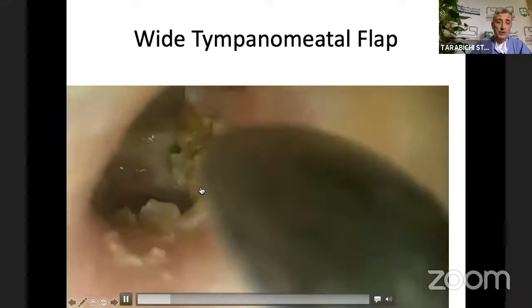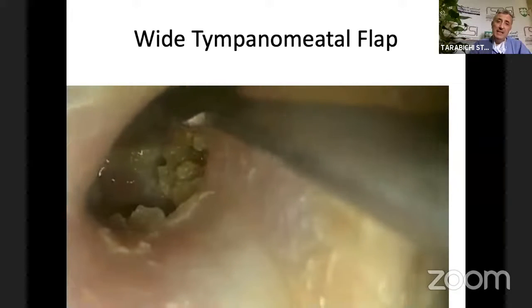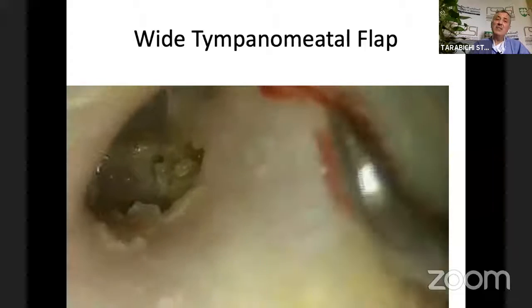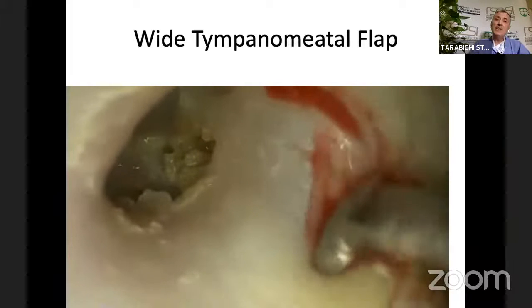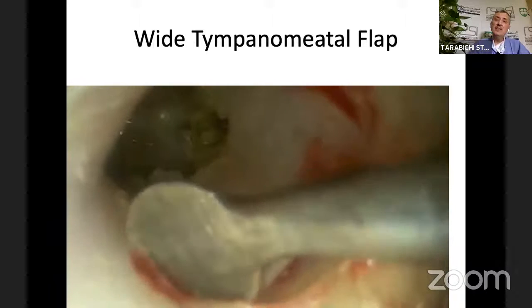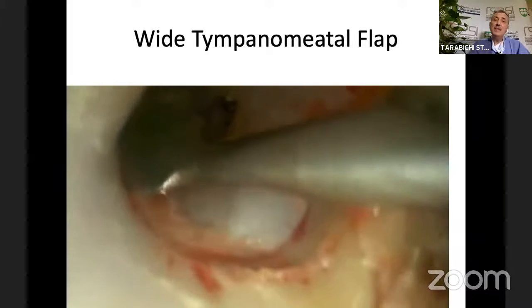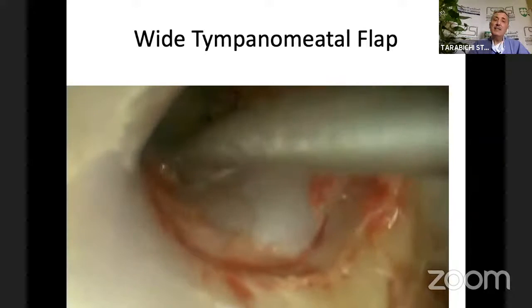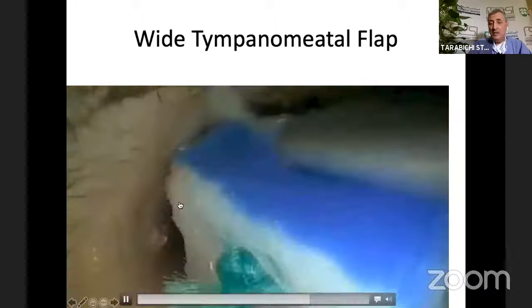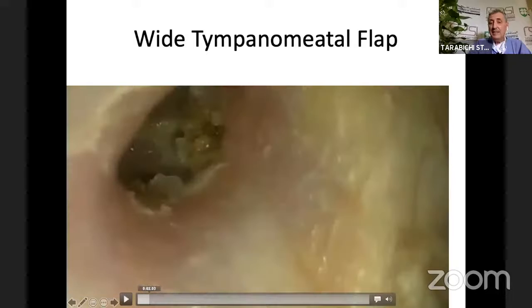I have some new videos at the end that I will share with you. But you can see how far I'm going, almost to 1 or 2 o'clock, making the turn, and then ending up almost parallel to the annulus, very anterior.